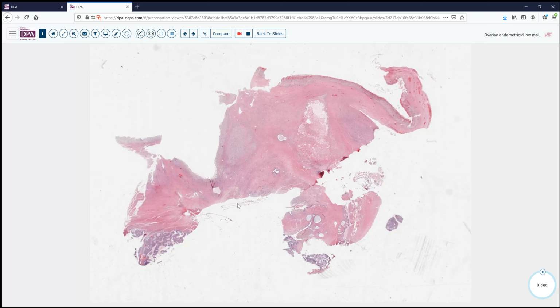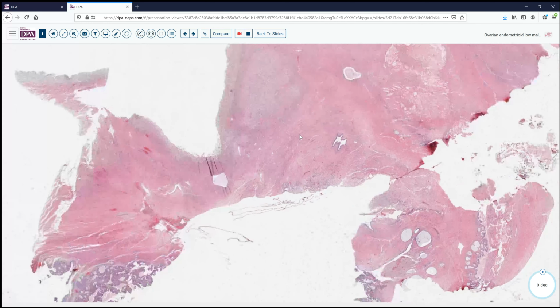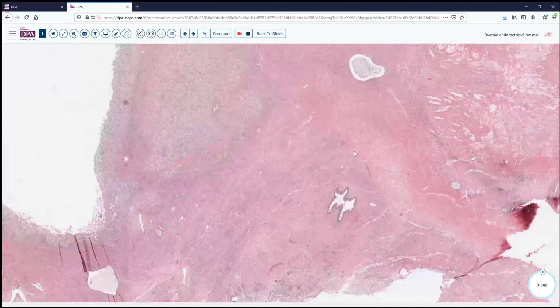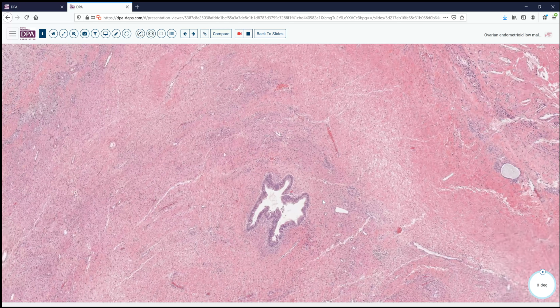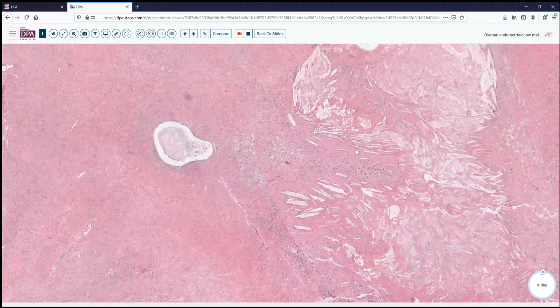Let's look at some other tumors here. Here again, we see a dense fibrous area, some cystic changes, and then a little bit more complex epithelium here. So looking first at this component, we see that we again have a nice tall columnar type epithelium, no significant endometrioid type stroma, maybe a little bit of condensed stroma here, a little tufting of the epithelium, but no cilia per se. We see here an area of old hemorrhage and maybe necrosis with cholesterol cleft formation.